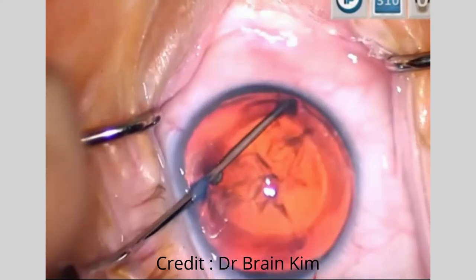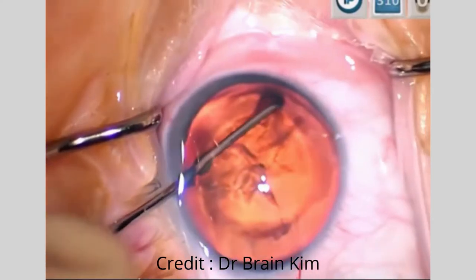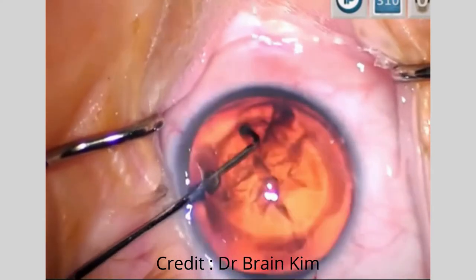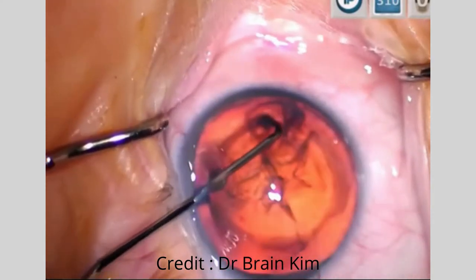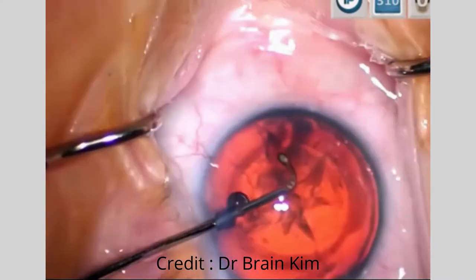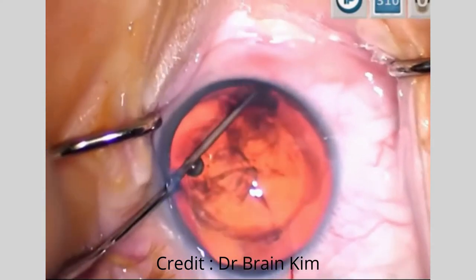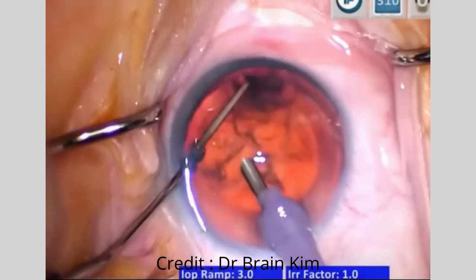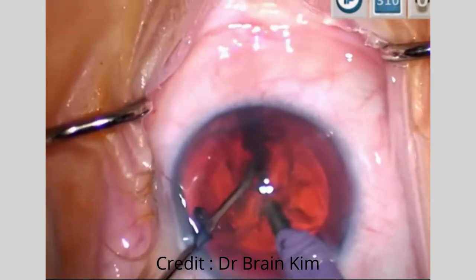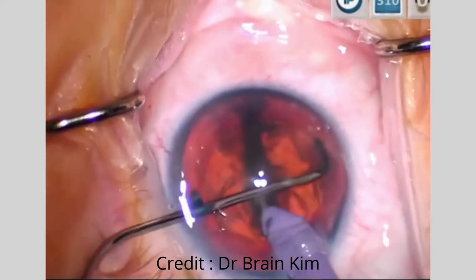This is a trypan blue stained eye for illustrative purposes. I pronate and then glide underneath the anterior capsule and then supinate. You can clearly see, because there's such a well-dilated pupil, that I am in the equator. I'm lifting the anterior capsule edge just to show you that I slid my chopper underneath it. Pronating and supinating to show you how easy and fluid the movements are — pronated to get under the anterior capsule out to the equator, supinated for the ready position. The chopper is subincisional, they meet in the middle, and fracture the endonucleus in half.